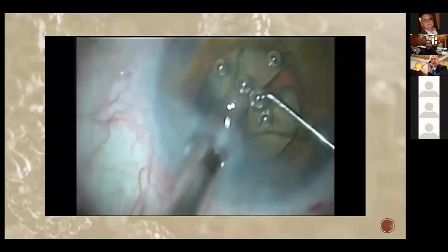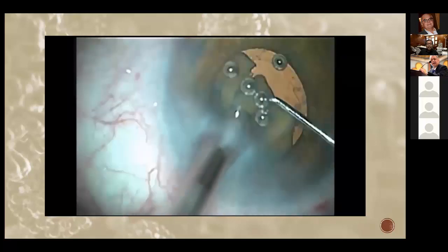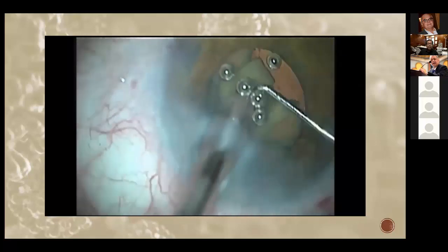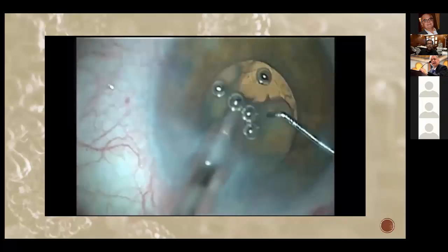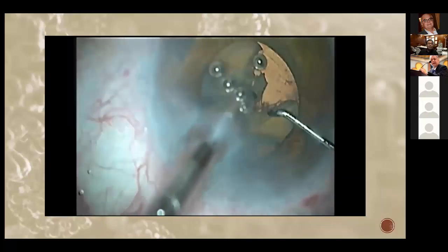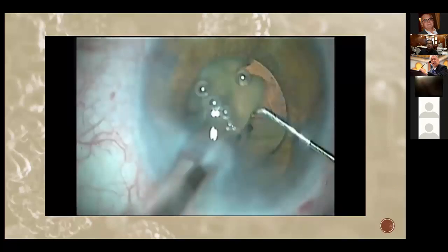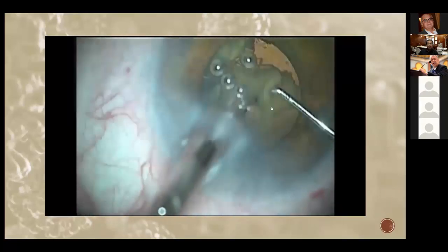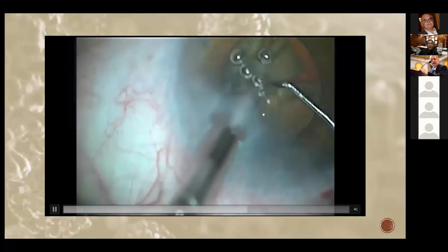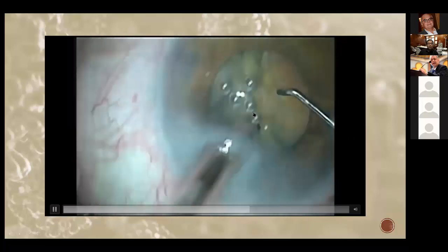And in my settings, I will show at the end of the surgery how I changed them. I change the rise time, the dynamic rise. I change the dynamic rise to a minus dynamic rise. So when I have an occlusion, my flow rate becomes less. I take my flow rate down when I have an occlusion. When I don't have an occlusion, I can have a flow rate that will let the lens fragments come to my phacotip.